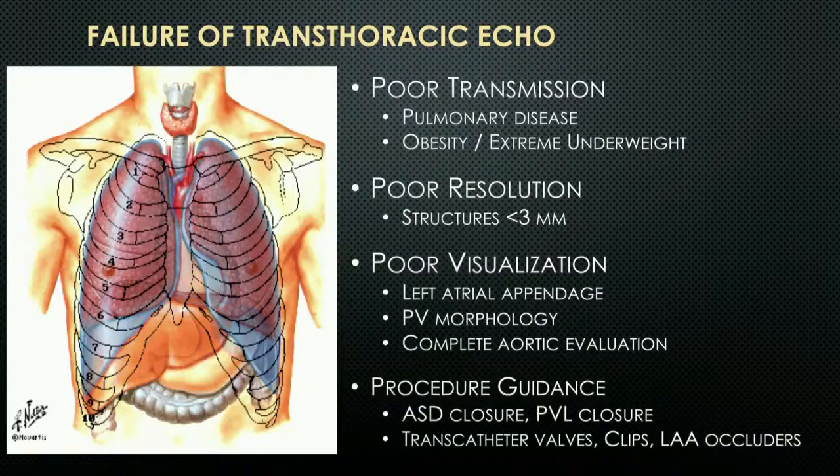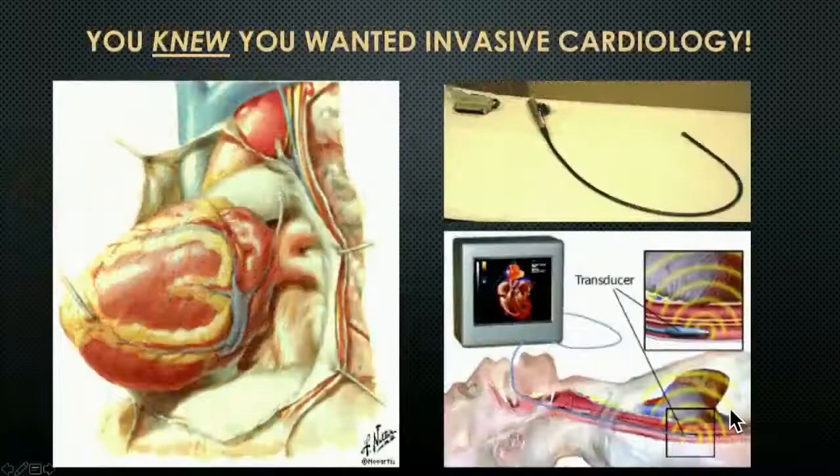And of course, we'll be hearing on Monday from Dr. Sarek the vast number of applications of both 2D and 3D TEE in terms of procedure guidance, where the typical transthoracic imaging windows are typically under sterile drapes and or interventionalists' fingers. So these are really where transthoracic leaves off and TEE comes to the fray.